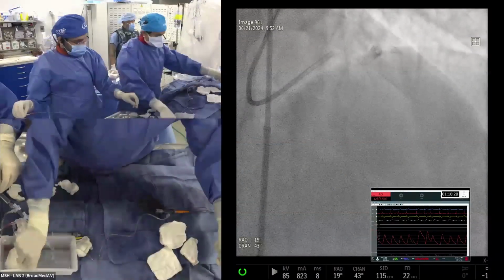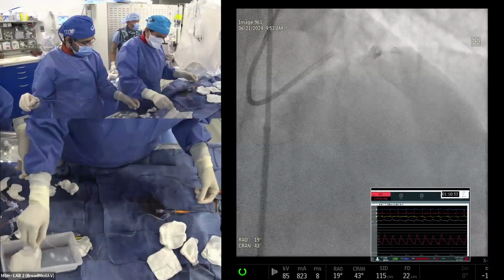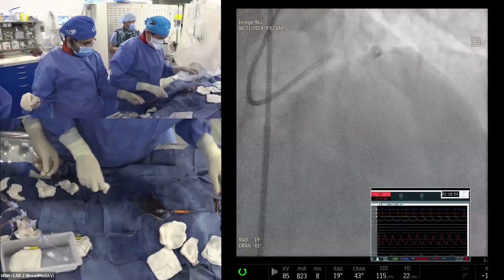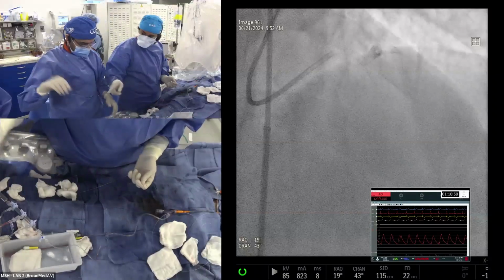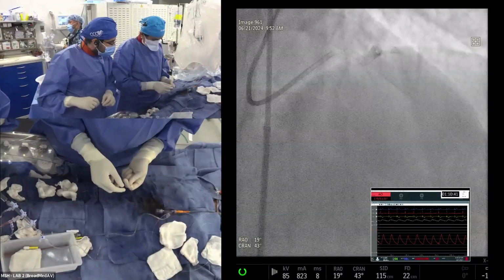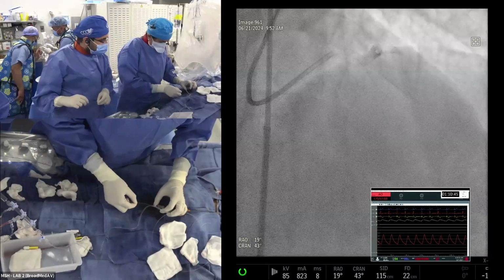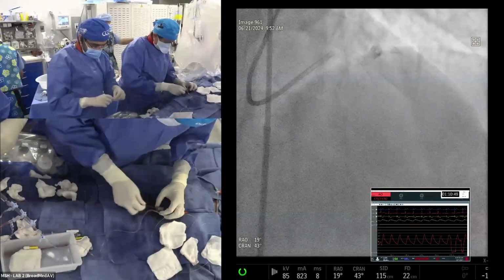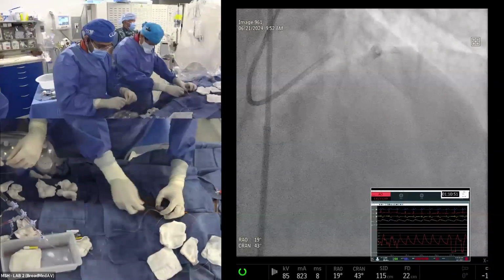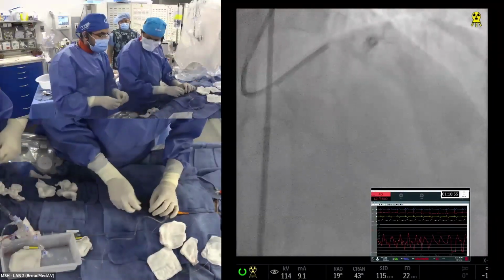Dr. Sharma, sir, I have a question. I'm Dr. David from Calcutta. If you want to do rotational atherectomy on both arms, like LAD and D1, which vessel will you rota first? Because you have to pull the wire out after rota. So I would say, very simply, the main vessel is the one where you want to make sure the result is good. So you'll do the LAD first. Right. Yeah. Thank you.